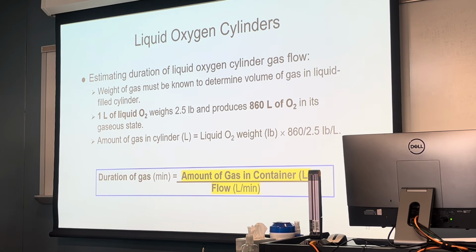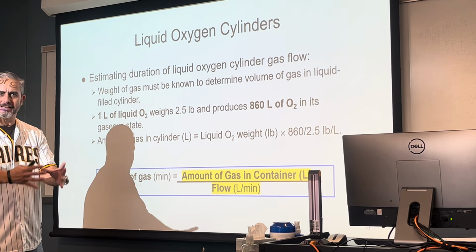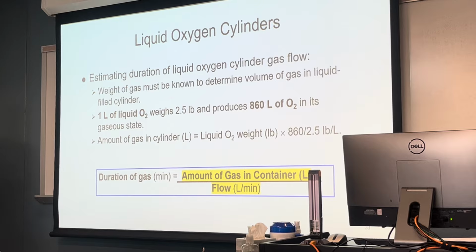Yep. Okay, and then is there a tare here? Like you would subtract what the tare is of the weight of the actual tank? You could, but the tank itself, the display may tell you the weight of the liquid that's inside of it. So instead of us having to physically place it on a scale and subtract for the apparatus itself, no. It would be displayed there, the weight.